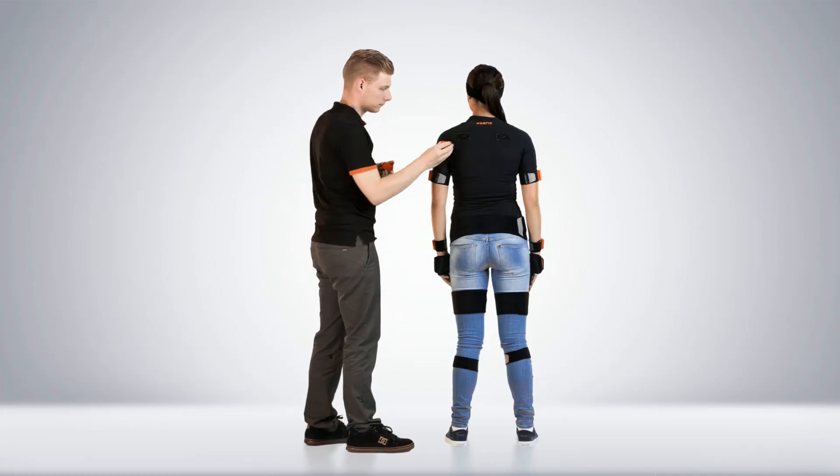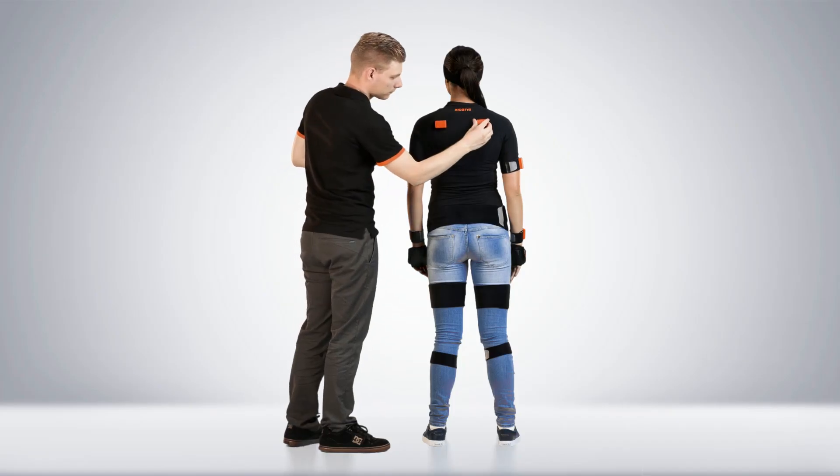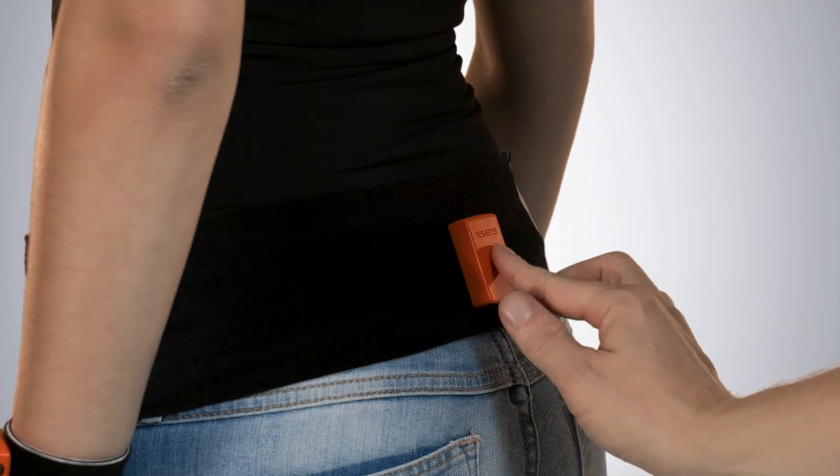Both shoulder motion trackers can be placed. The pelvis tracker needs to be placed on top of the sacrum.